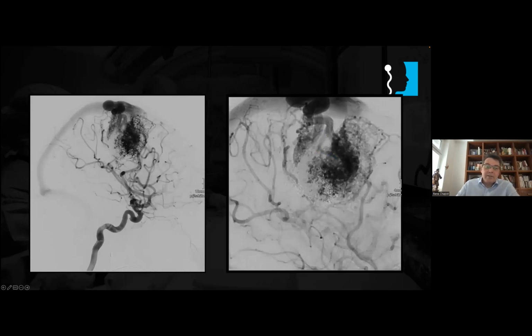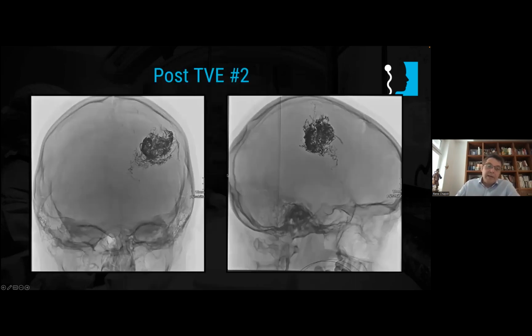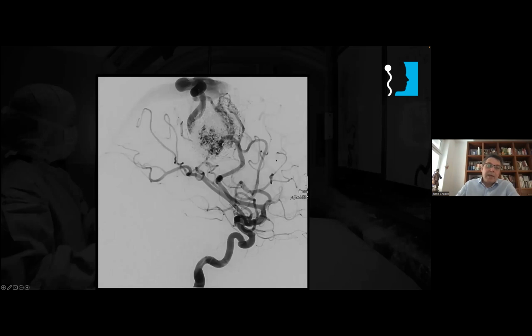And for second transvenous embolization, we considered to take this vein here. This was second transvenous, where we went selectively to that vein here. Here we're on the way. This is here plug number 2. It's a second step. Each step requires 3, 4, 5 hours. It's a long procedure. But step number 2, we go to this vein. We occlude second part, first part, and then this is a remainder.